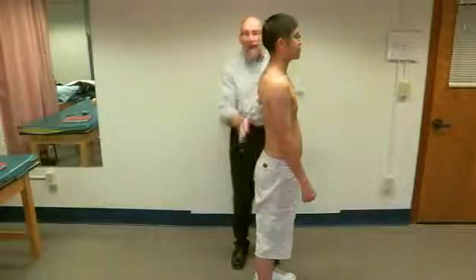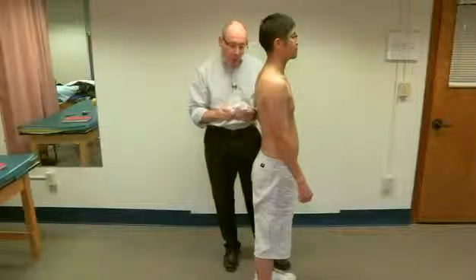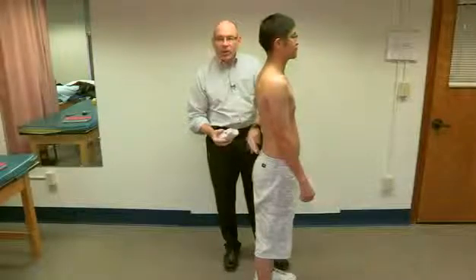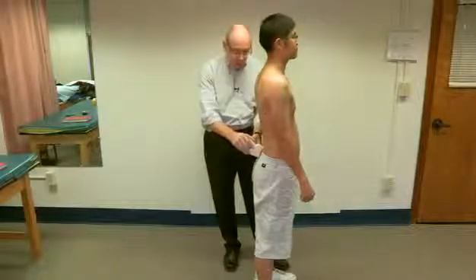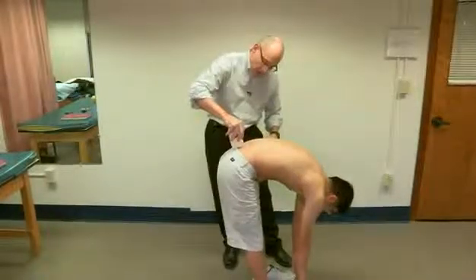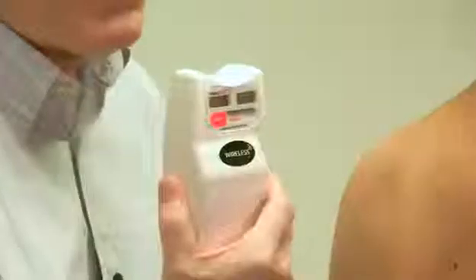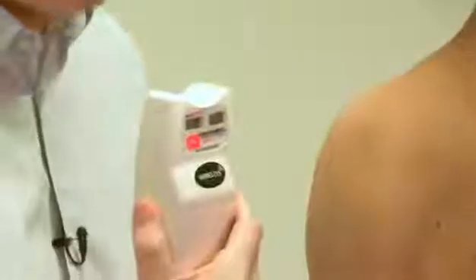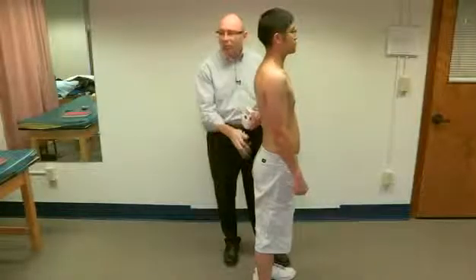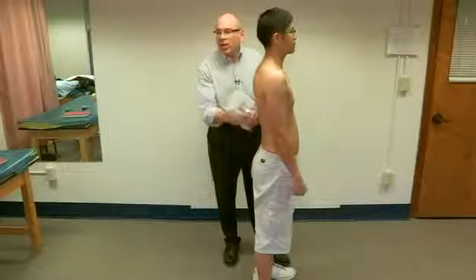That measurement of flexion was for everything — it did not account for what was happening at the hips. So we're going to re-measure by placing the inclinometer over the sacrum at the PSIS line and setting the device. The subject leans forward as far as he can, and we end up with 49 degrees. We subtract this from the 104 degrees, which gives us how much range of motion can be attributed to the lumbar spine.